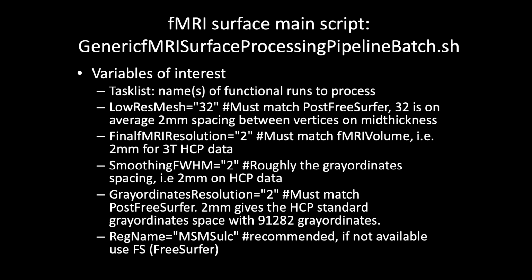The image resolution is also specified, as is the spatial smoothing. And then we're using the MSMSulc setting to allow us to register across the sulci.